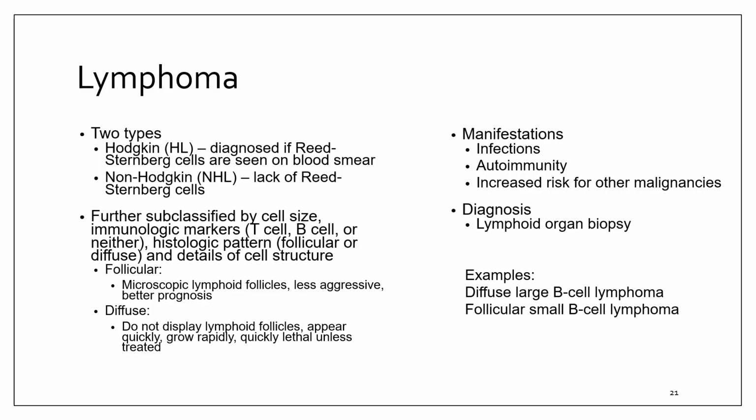Okay. Think of lymphomas like neighborhoods. Follicular lymphoma is the planned community. It's organized. It has HOA vibes. Diffuse lymphoma is everything bulldozed, no structure, absolute chaos. Histology tells that story instantly.